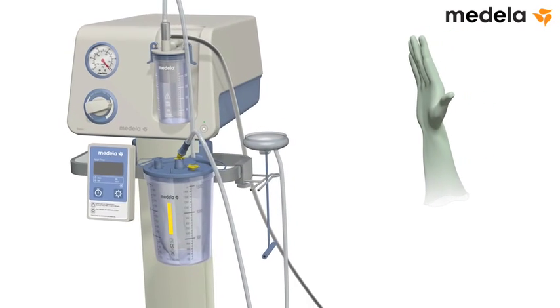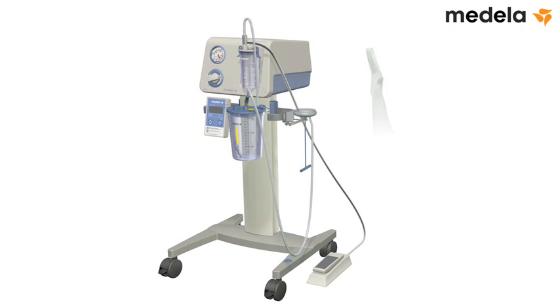Return the foot-controlled vacuum regulator to its resting zero-pressure state by pressing the back part down using the heel of your foot. The equipment is now ready for use in the vacuum-assisted delivery procedure.